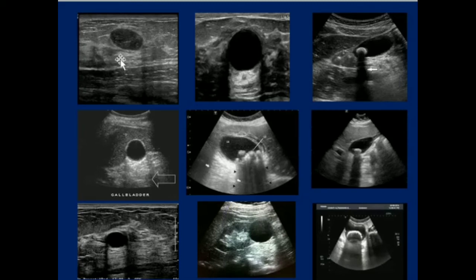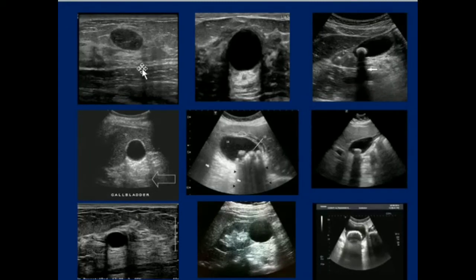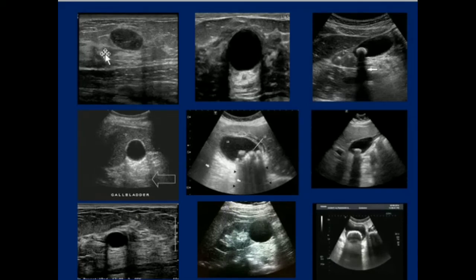In this image we can appreciate a solid hypoechoic lesion in the breast tissue, and this shows posterior enhancement. So it was labeled as a fibroadenoma. This is the normal gallbladder distended with posterior enhancement.